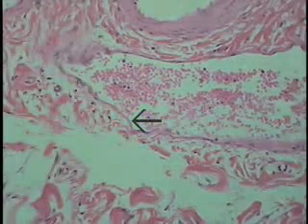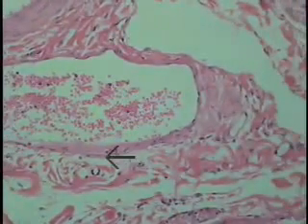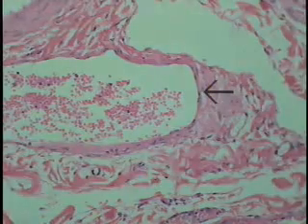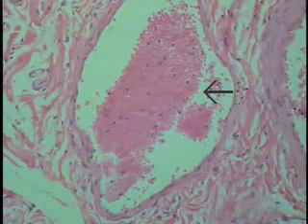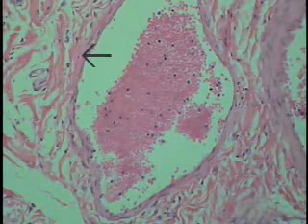On this particular aspect of the wall, it is extraordinarily thin, mainly an endothelial lining supported by an adventitia. And maybe due to the cut or just how veins are, one can make out just a little bit of more tissue coming in the supporting wall on this aspect, and may contain some smooth muscle cells. Here's another small artery, yet larger caliber, and its companion vein located to its side, and that shows similar features to the vein that was just examined, but this one illustrates it a little bit better. The endothelial lining with its supporting adventitial, tunica adventitia, the collagen there.